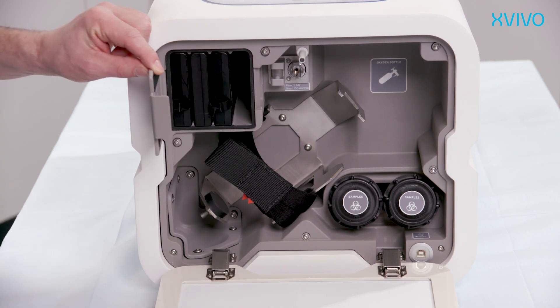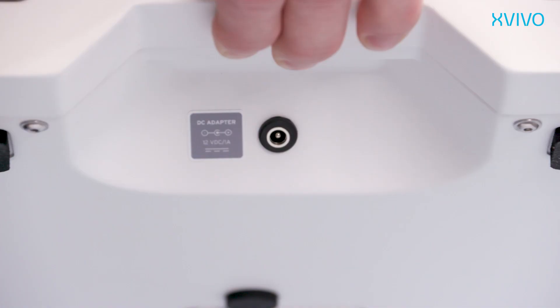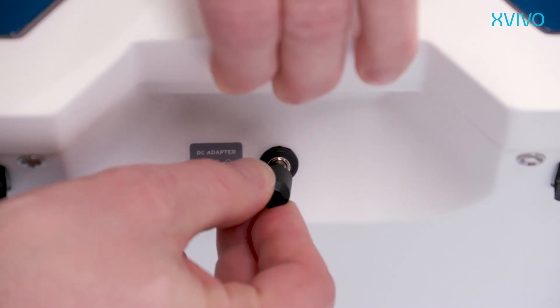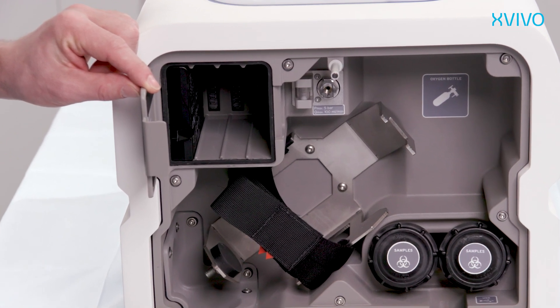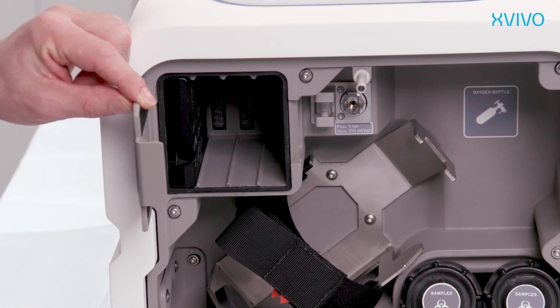Alternatively, the supplied AC power adapter can be used to power the device. Connect the adapter to the port at the device and connect the power plug to a reliable power source. Be advised to always leave one fully charged battery in the battery compartment to serve as a backup during any power failure or interruptions.